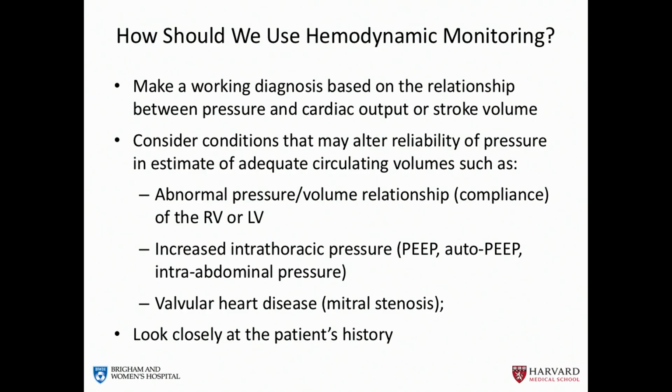We also have to consider valvular heart disease, specifically diseases like mitral stenosis. And I think it's really important, before you can truly interpret hemodynamic monitoring, to take a good look at the patient's history.